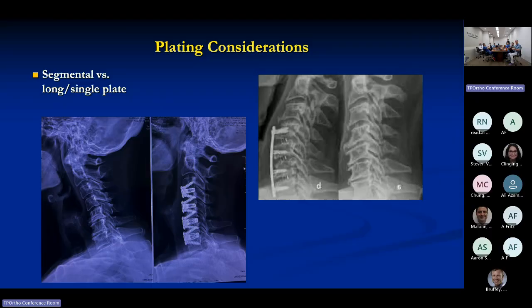Both top and bottom. It's that 5 millimeter number. Now, the reality is that's them looking at it after the fact, that when you use variable screws, it's subsidence, your plate can migrate there, and it creates the same problem. So staying as far away as you can probably allows a little bit of settling without encroaching.